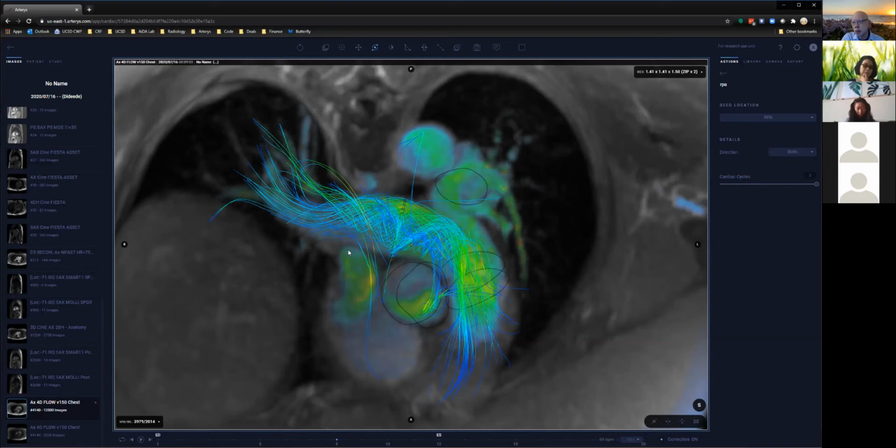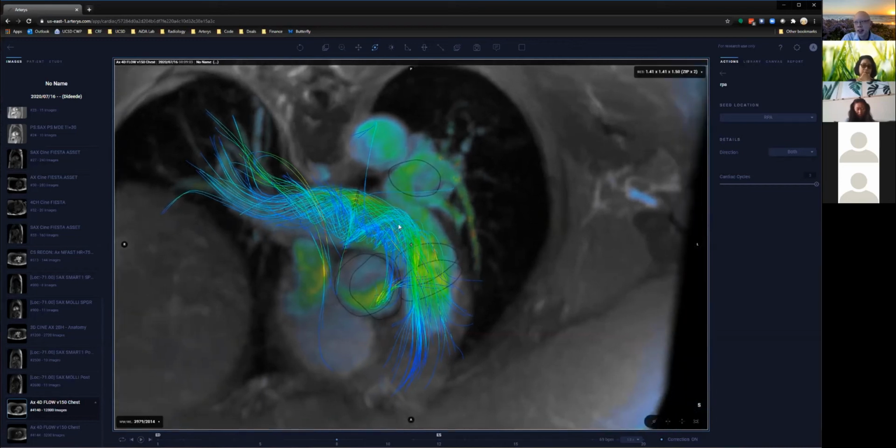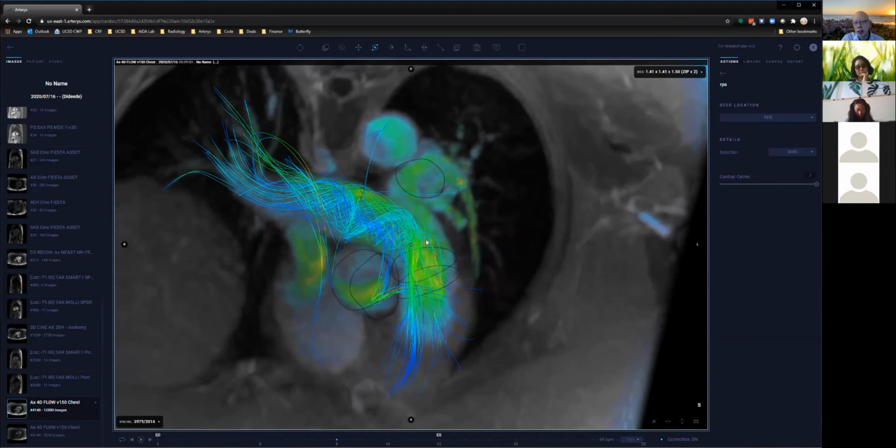And that was a key paper for us to get out there so people could understand this concept. Where you have more laminar flow, near the pulmonary valve for example, you can trust that more. Where you have very vortical flow, the numbers tend to degrade quite a bit. And so when you have inconsistencies in your measurements, that can help you quite a bit.